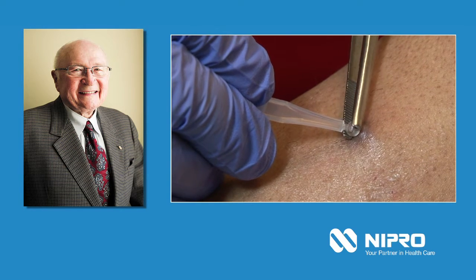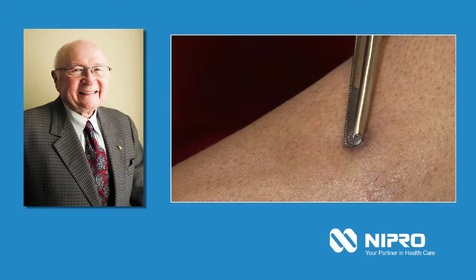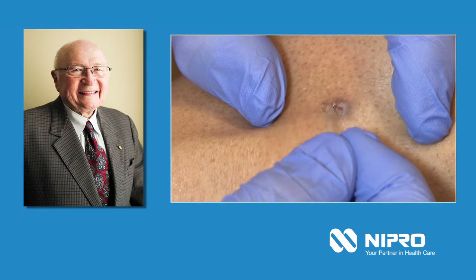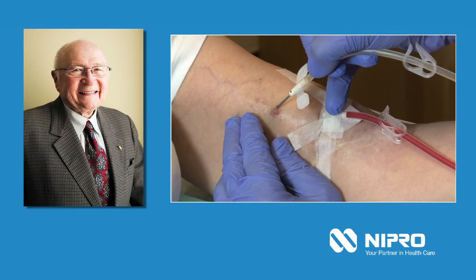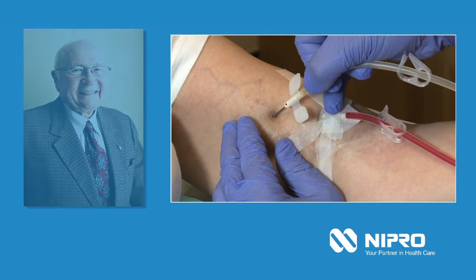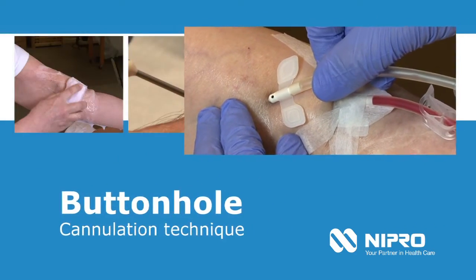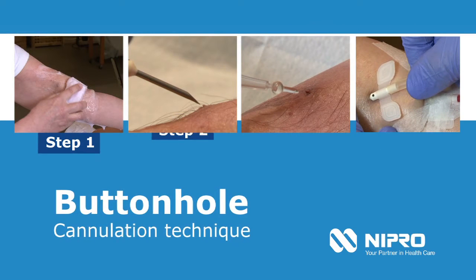Here one can clearly see that this patient, who has been on dialysis for several years, has only two puncture sites: one arterial and one venous. The goal of this video is to familiarise practitioners with the technique and to demonstrate the four different steps required for a successful result.